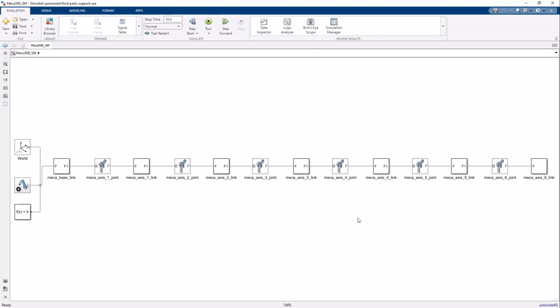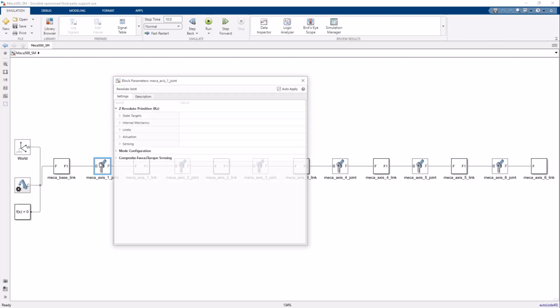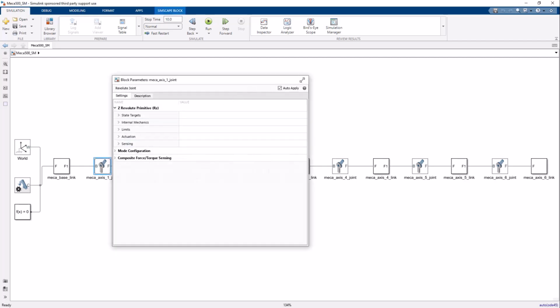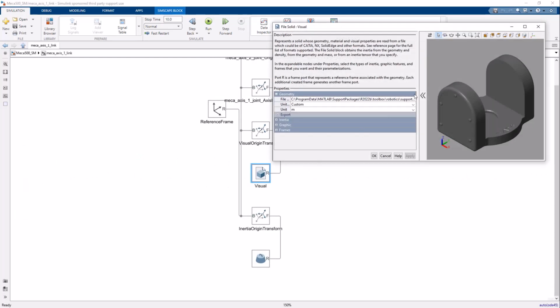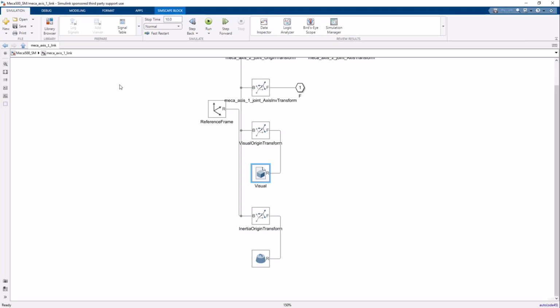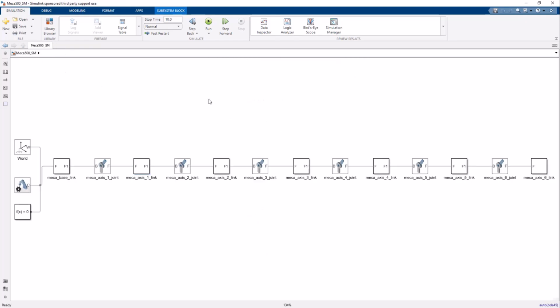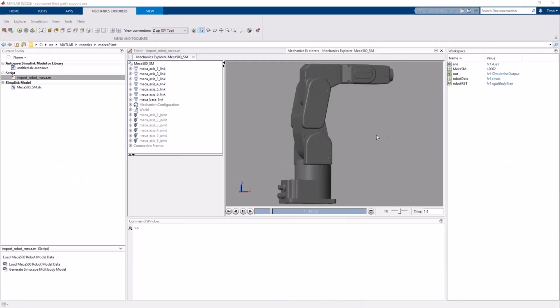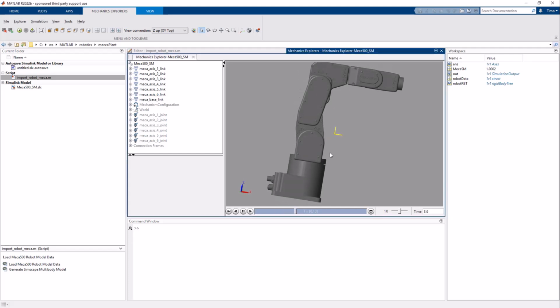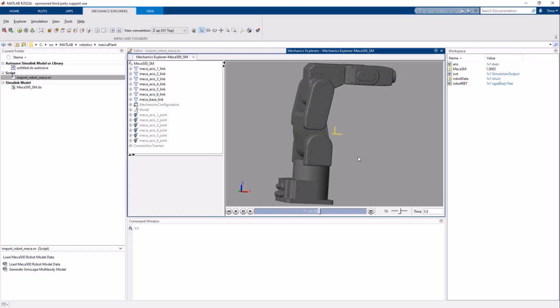Here we can see the generated links and joints, adjust parameters such as inertia and mass distribution, or let MATLAB automatically calculate these values from the part's geometry. When we simulate this model, the Mechanics Explorer shows us a 3D visualization of the scene. This is just a blueprint model with no controller yet, but it can quickly be used to perform kinematic or dynamic simulations and develop motion planning and motor control algorithms.